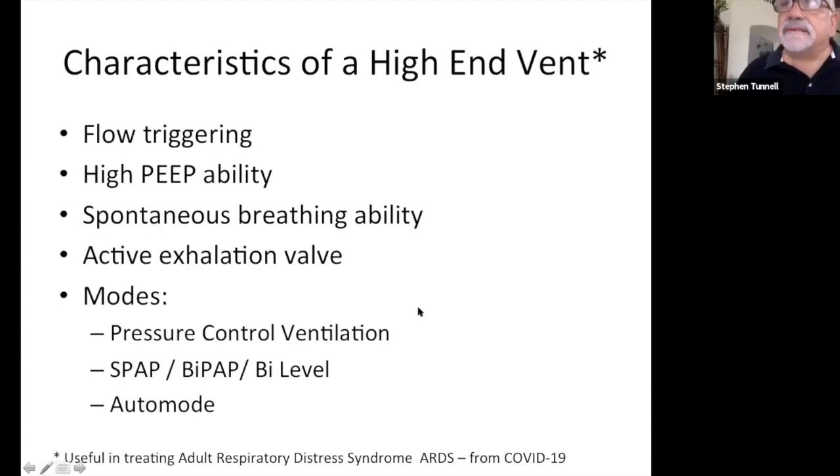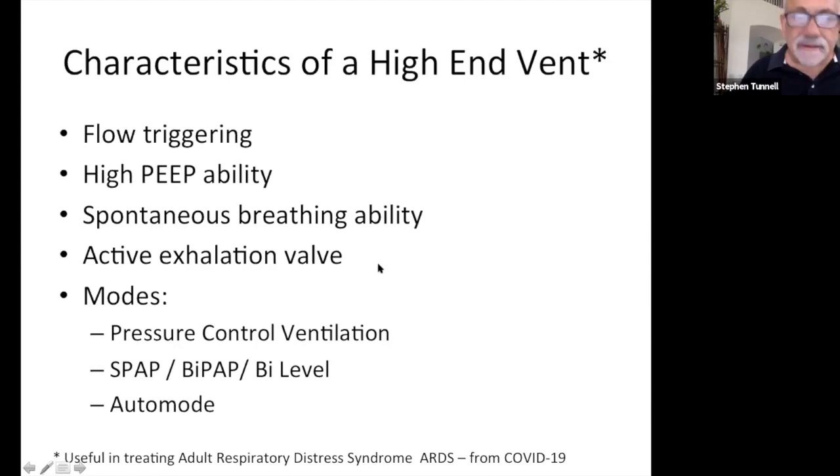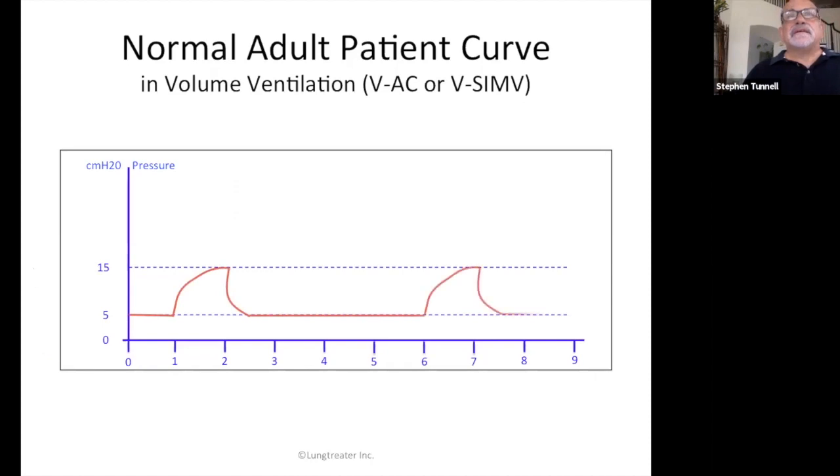So tidal volume is the gas that's moved in, and I'll send you a picture of volumes and pressures. It's important to look at that, to give you a sense of the physiology of breathing. When we look at the screen of a ventilator, we see increasing and decreasing pressure.